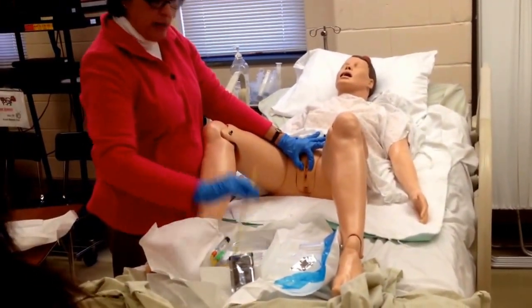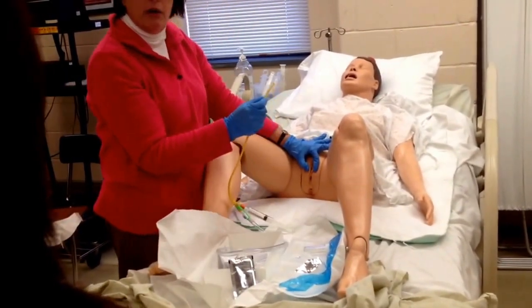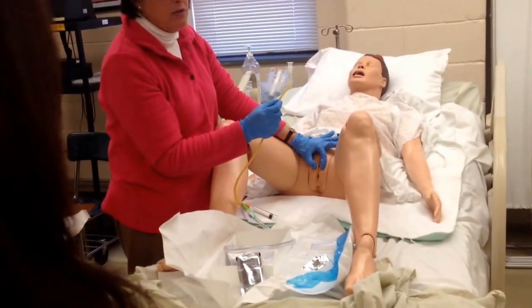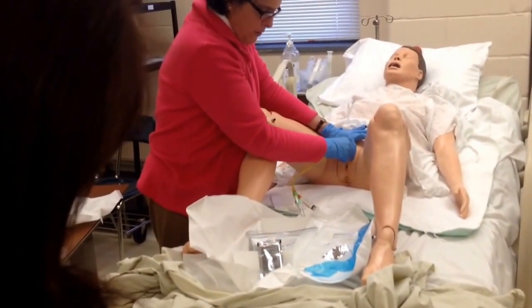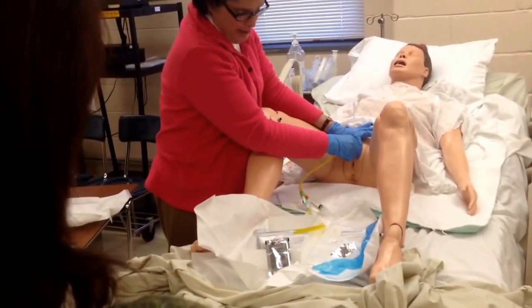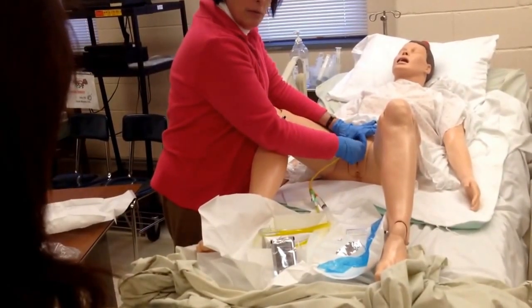So then you're ready to pick up your catheter, dip it in your lubricant, and you're going to insert, okay? On a female, how far do you go? 2 to 3 inches. On a male, 5 to 7 to 8, okay? So we're going to insert, and we're going to look for the liquid gold, okay, because that's what it is, liquid gold. There we go.